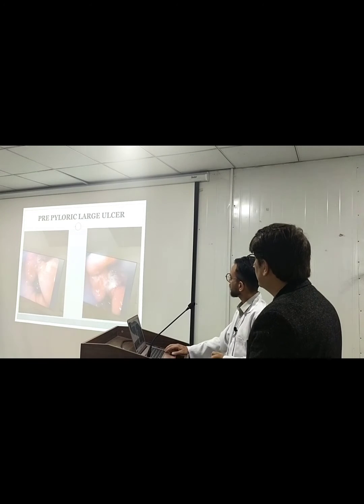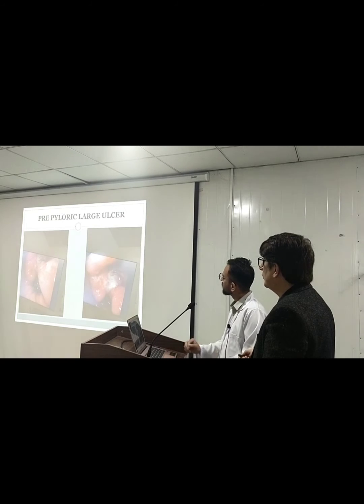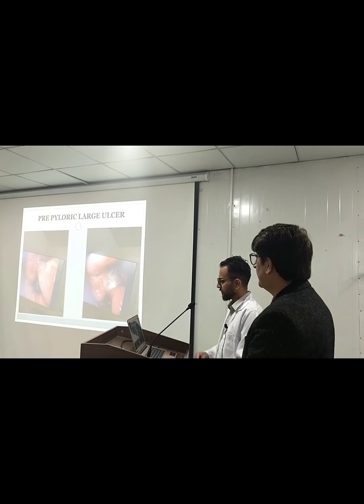Pre-pyloric large ulcer. So this is a pre-pyloric ulcer. In this case you can see it looks a bit nasty, with surrounding edematous mucosa. So we took biopsies. This patient also presented with melena, plus he had weight loss and anorexia. That's why we took the biopsies of this ulcer. But fortunately this was not malignant, it was a benign ulcer. Later on we confirmed on biopsy.